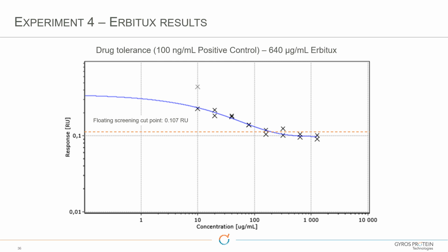The good thing with things like ERBITUX and other biosimilars is that there normally are scientific guides out there that the regulators have summarized the performance and indications of the drug. And these can be used to know what your expected concentrations are going to be, the pharmacokinetics. So you know what your assay needs to be clinically relevant.